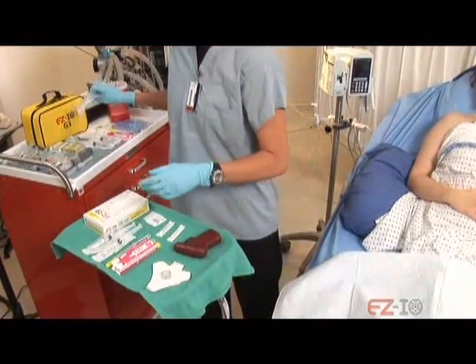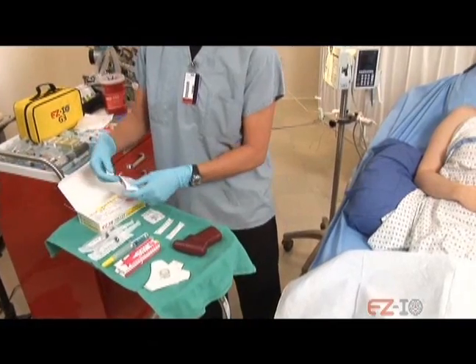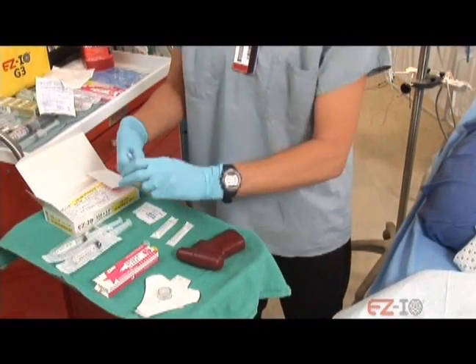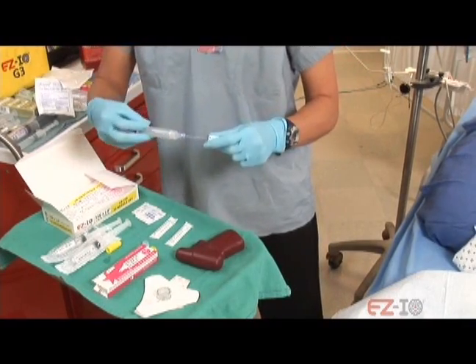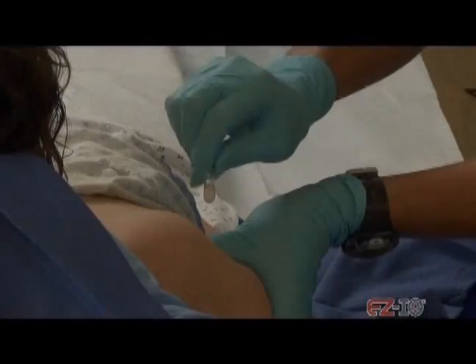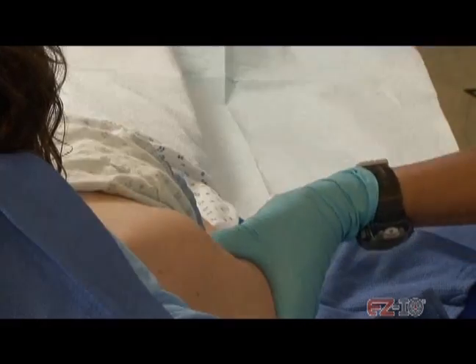When you're ready to place the needle, remove the Easy IO driver from the case and remove the trigger guard if present. Select the appropriate needle set and inspect the packaging and cartridge for damage. Open the Easy Connect tubing that comes with the needle set. If the patient is responsive to pain, administer 2% lidocaine without preservatives or epinephrine, also known as cardiac lidocaine, for anesthesia prior to your initial saline flush. Prime the Easy Connect with the appropriate amount of lidocaine. Once your Easy Connect is primed, clean the insertion site according to your institutional policy for aseptic procedures.